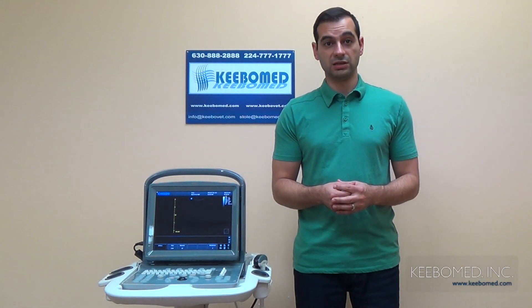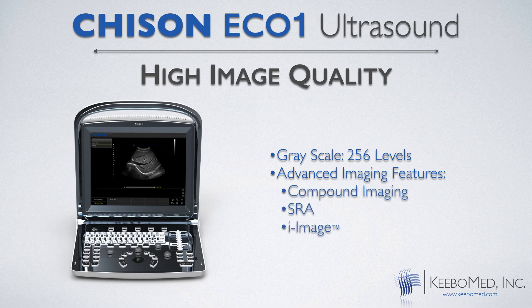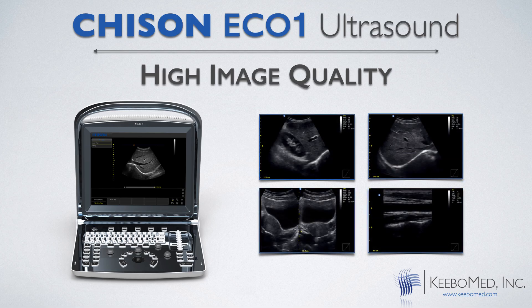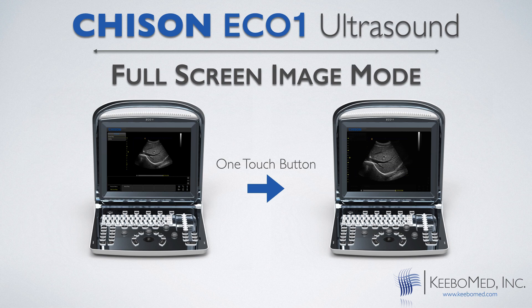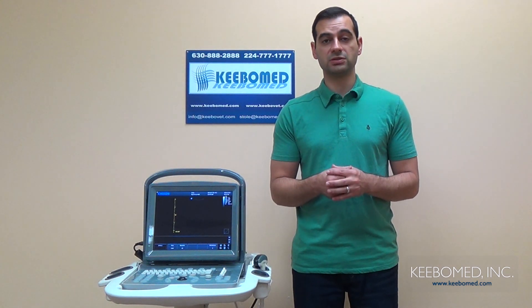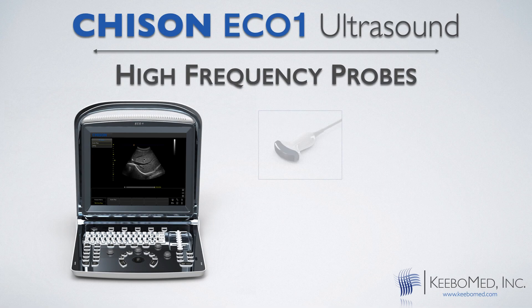The Eco1 does produce high image quality as well. It has a 256-level grayscale and has advanced imaging features such as compound imaging, SRA, and iImage, which is image optimization software. It also features a full-screen imaging mode with a press of just one key, which is important because it allows for better diagnosis. The display modes of the Eco1 are B, BB, 4B, M, and BM. The Eco1 also supports many different probes that have a high frequency, which will provide a fast and accurate diagnosis. These probes include convex, linear, microconvex, and transvaginal.